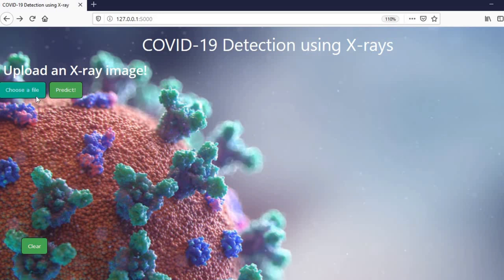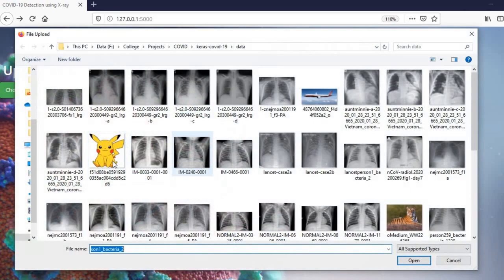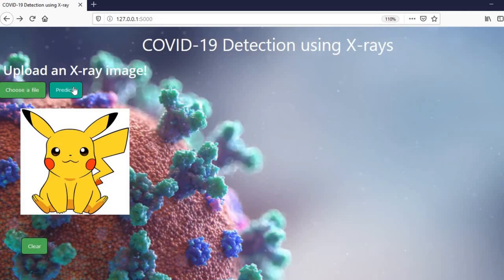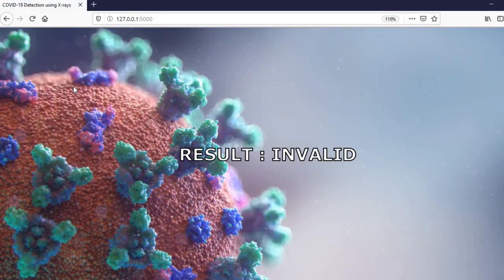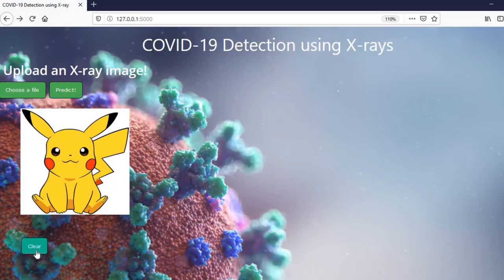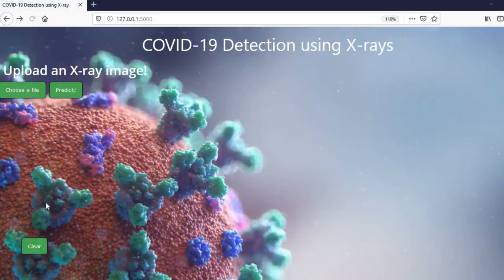Now, we will make our prediction on a random class of image to check our model. And here we got our result as invalid. That's it for the demonstration of our application.